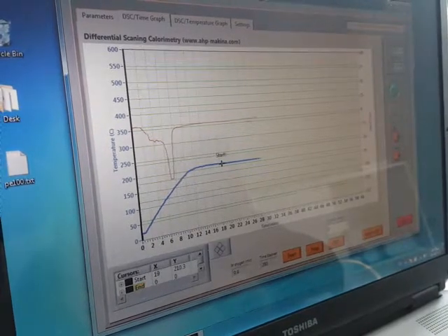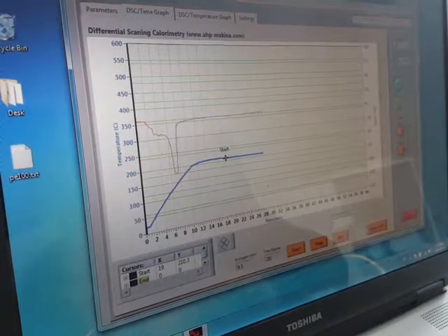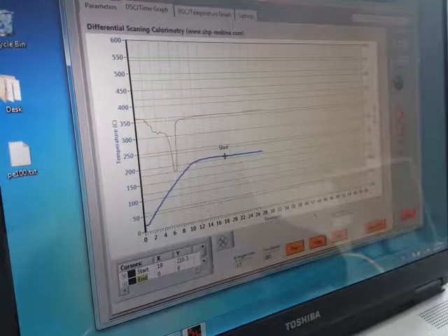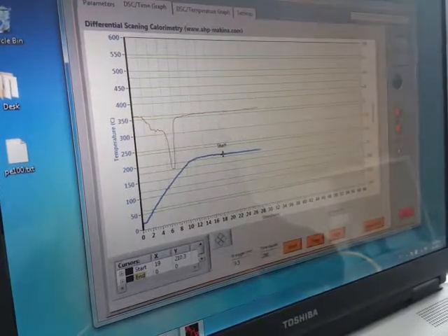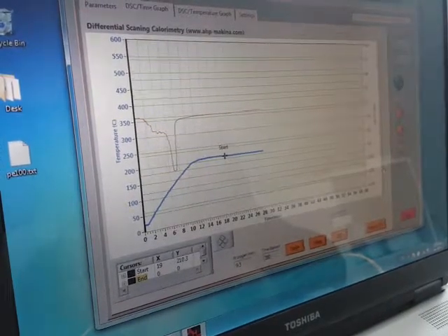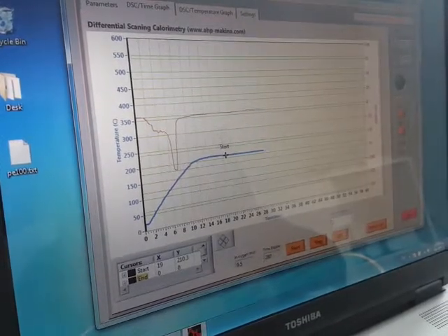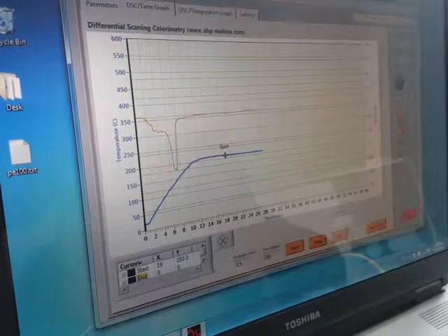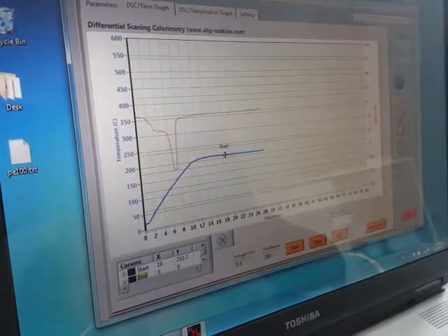For now, we don't have oxygen input to the chamber because there is no balloon gas here, and I'm stopping. After the machine stopped, the cooler is on. It means that the air input of the chamber is on, and when you connect the air input, as I showed you in the machine demonstration, the air input will be on and the chamber starts cooling.